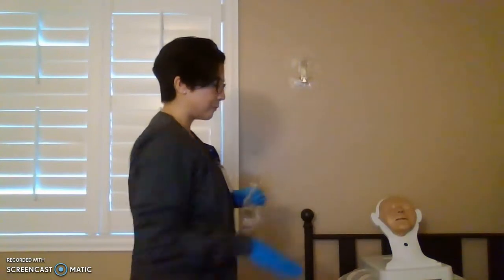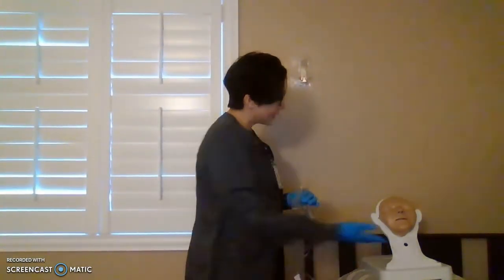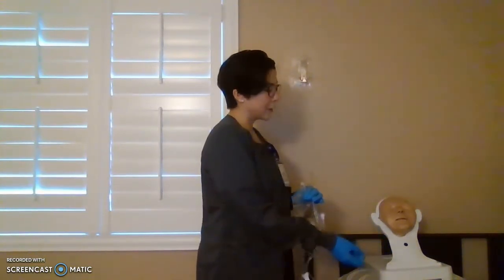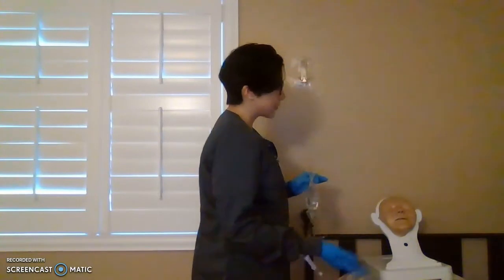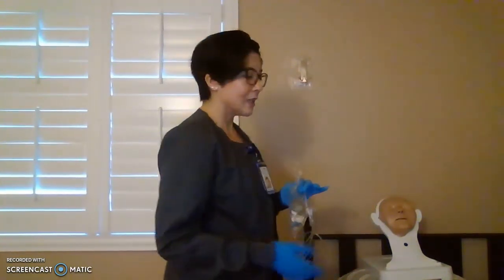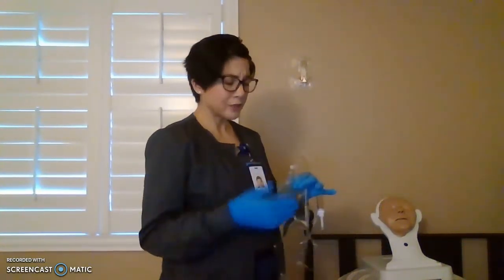So you have all your equipment. You go in the patient's room. Knock, knock, knock. Hi, can you please check your patient identifiers, your name and date of birth? Thank you. So as we talked about earlier, Mrs. Smith, are you ready to infuse this medication? Patient says yes. Hand wash when you enter, and then hand wash, don your gloves.